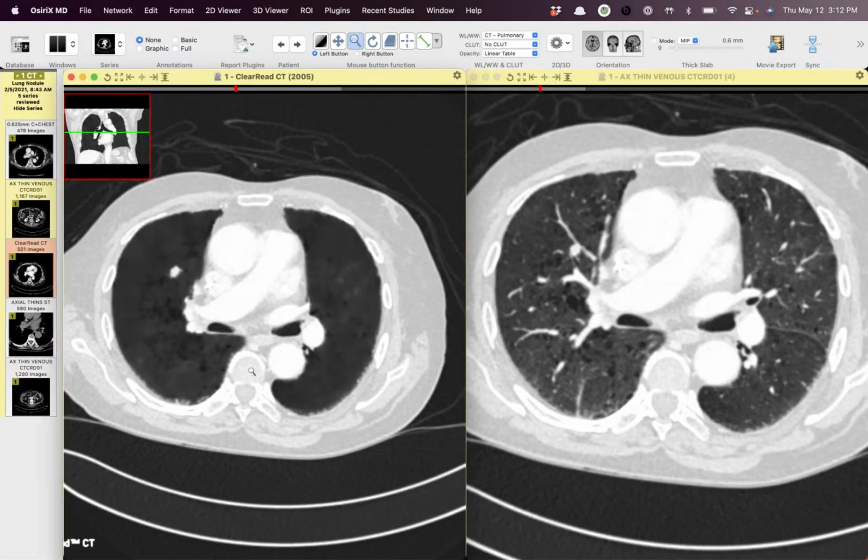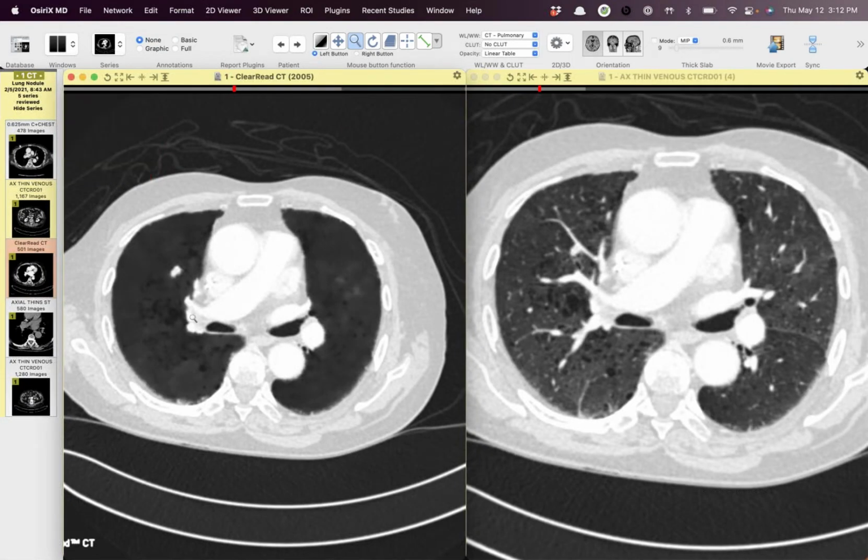Anyone? We use the same product, and it comes as part of their CAD. The CAD has its own limitations, but I love the vessel suppression. I actually have a viewport set up so that I have them loaded in parallel, so I can just scroll through them. It's sort of my second survey. We have found several cases like yours where there's a subtle cancer or metastasis that's hiding near central vessels. I know, talking to a friend at Michigan, I think they have the full CAD system. We don't have a CAD, we just have this.